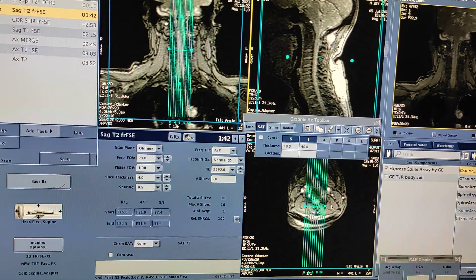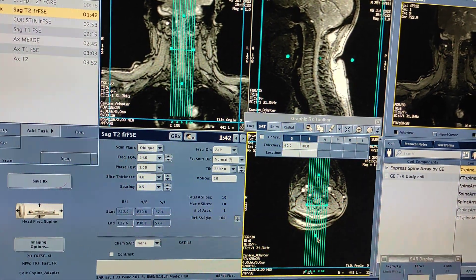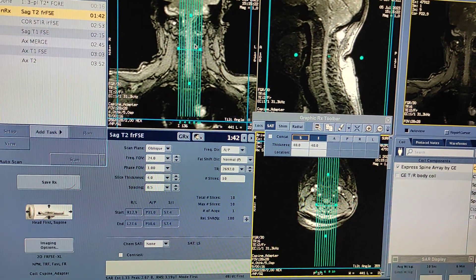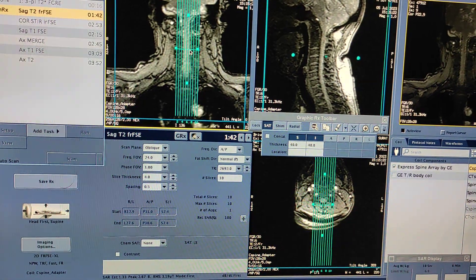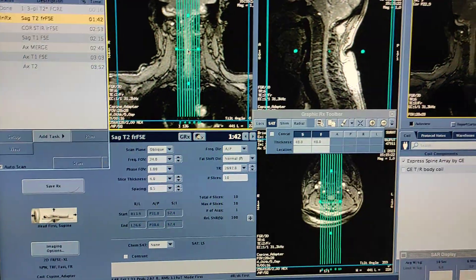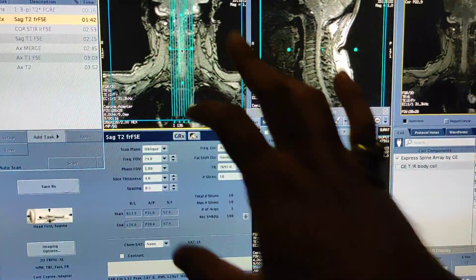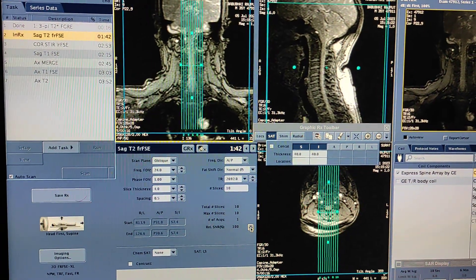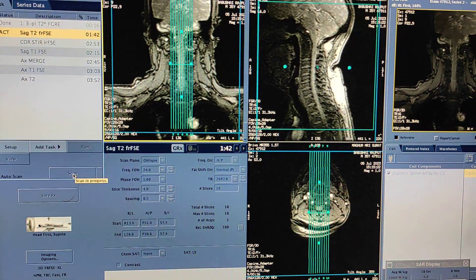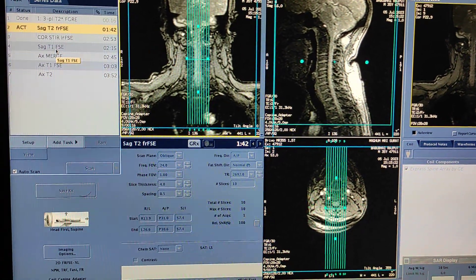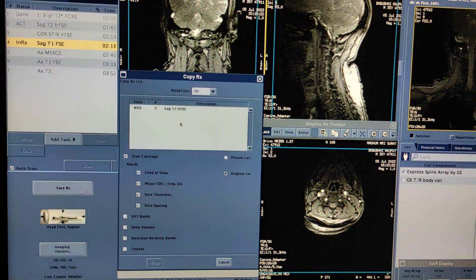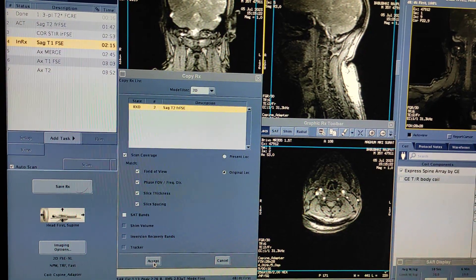For sagittal T2, keep in mind you have to take slices right to left — some take left to right, but ideally all are taking right-to-left slices only. Start sagittal T2. Then simply click on the sagittal T1 weighted sequence and copy RX — the white portion is 'RX Copy' with sagittal T2 — and accept.